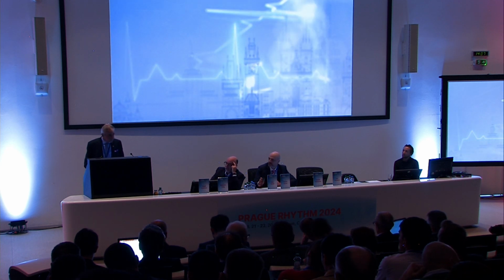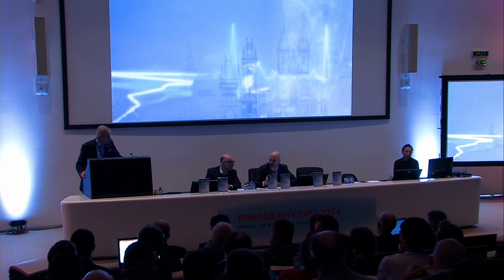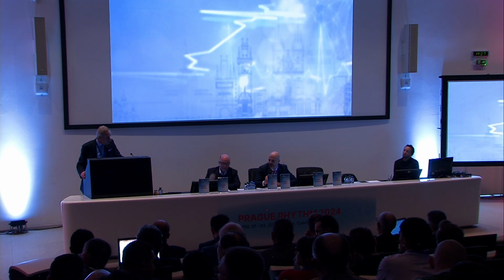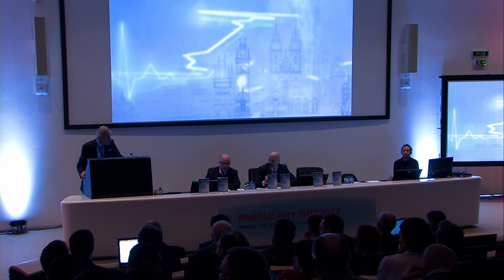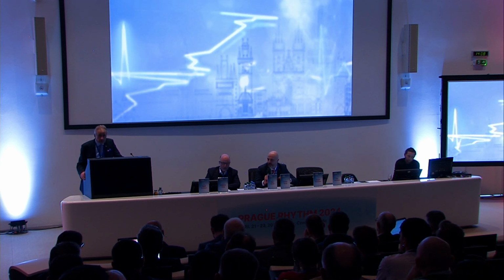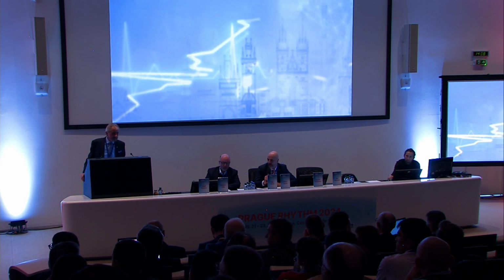Yeah, it's not perfect. Just one comment about the different catheters. There are data that different generators can provide slightly different outputs and different impedance. For example, the old Stockert generator, if somebody is still using that, at some impedances it delivers much more power into the tissue than the others. So be sure to use what you are used to in your lab, and do not just copy what other people do, as it may not work in your place.